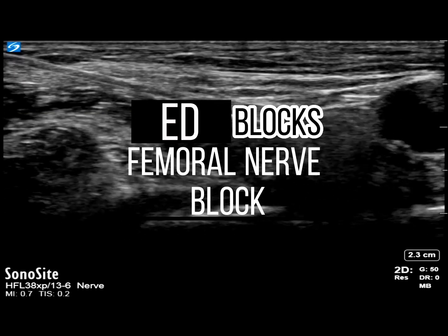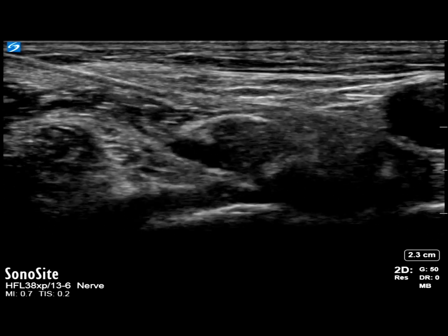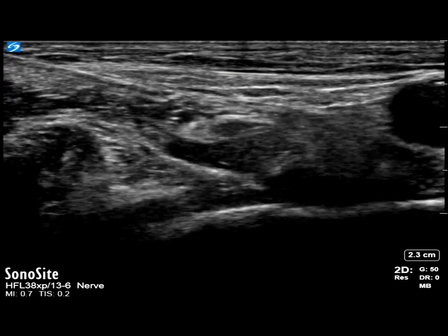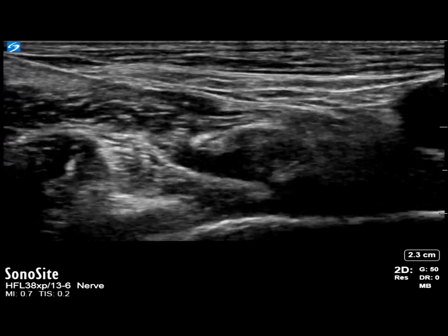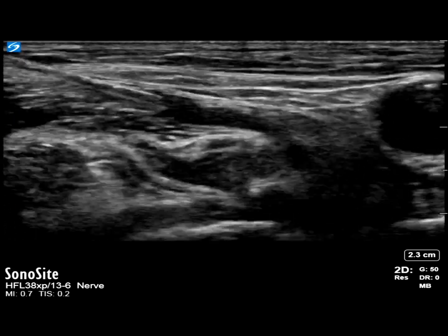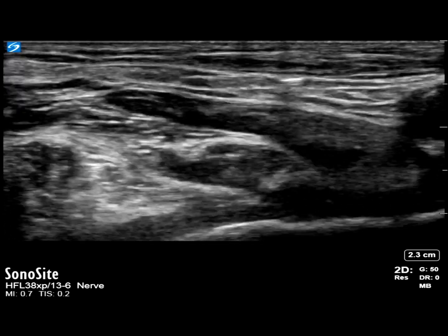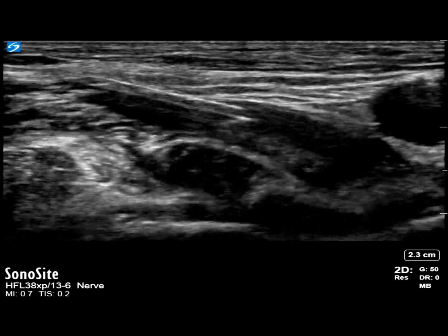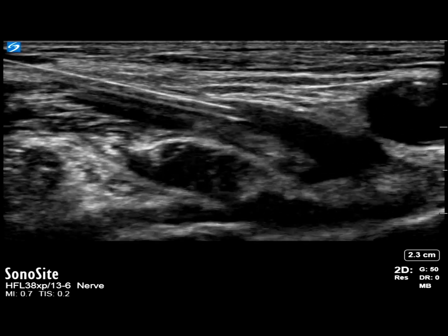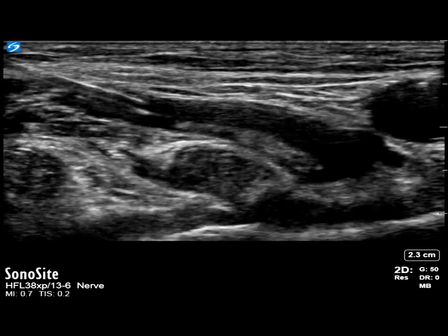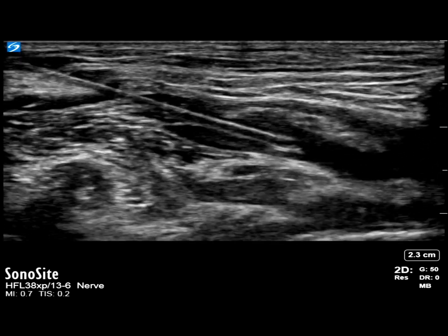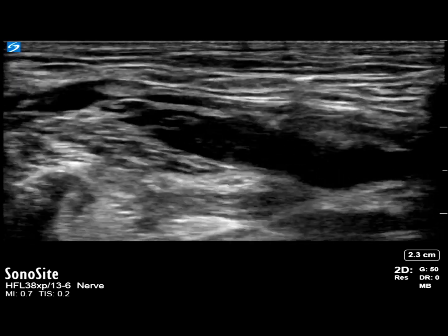Femoral nerve block is great for an emergency hip and femur fracture. This patient has chronic kidney disease, type 2 diabetes, and ischemic heart disease, who had a fall and suffered a subtrochanteric femur fracture. She had received IV opioids but still had significant pain and severe quadriceps spasm. We decided to perform a femoral nerve block to help with the pain from her hip fracture.